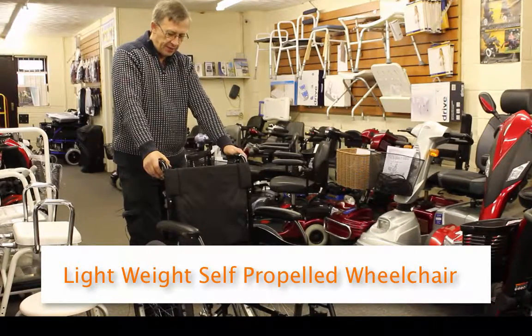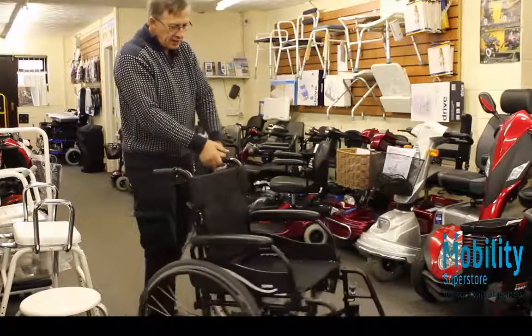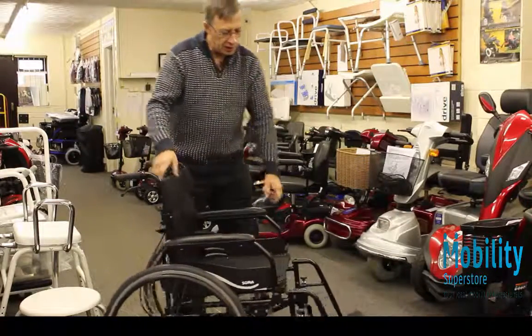Today we have a lightweight self-propelled wheelchair. These wheelchairs you can quite easily fold up to put into a car.